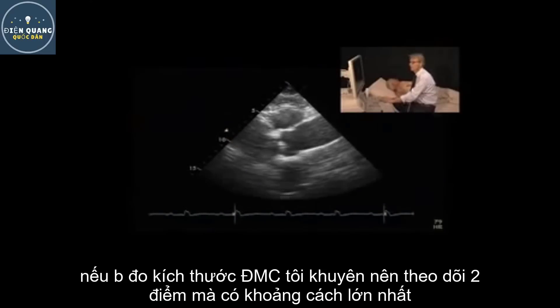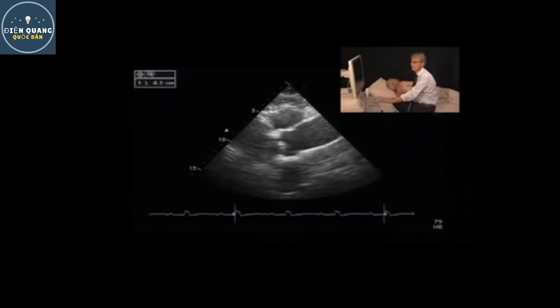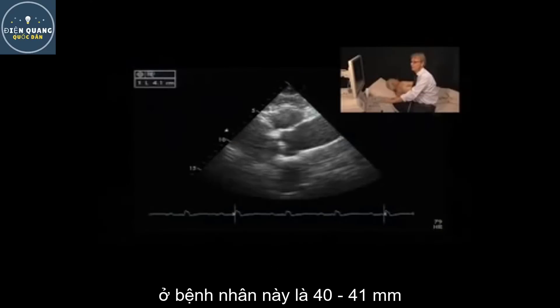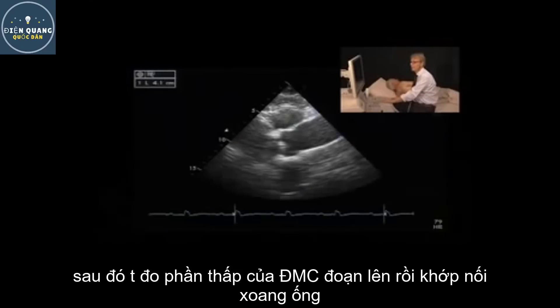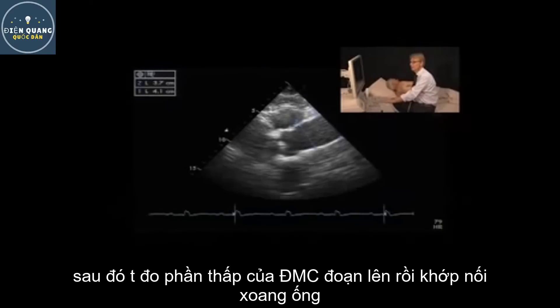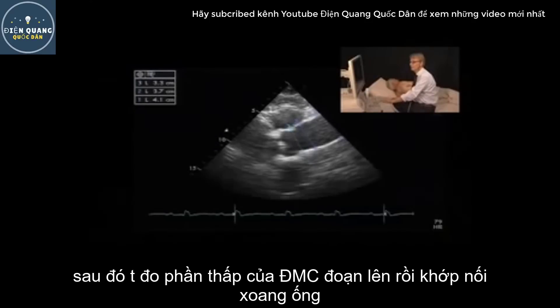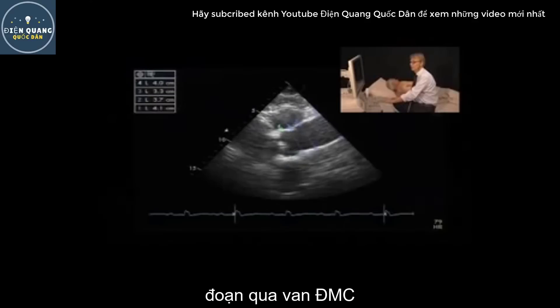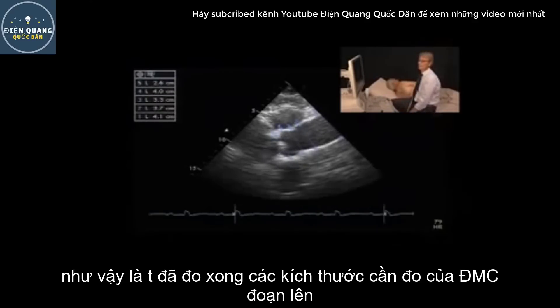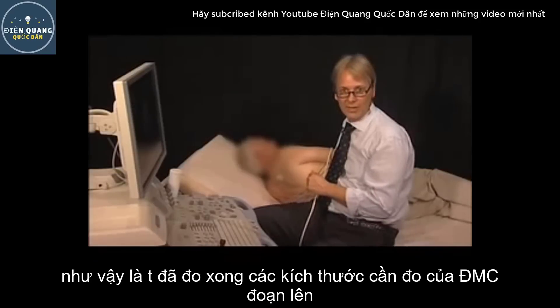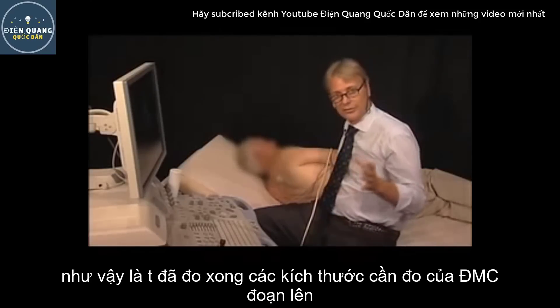When measuring the aorta, I would recommend the following positions: always at the vicinity where it is the largest, then at the caudal portion of the ascending aorta, at the sinotubular junction, at the aortic root, and also at the insertion of the aortic valve. By doing these measurements, you have completely described both the size and the shape of the aorta.